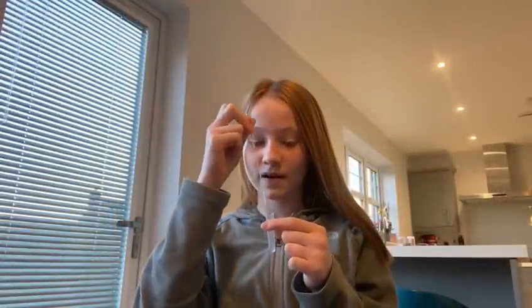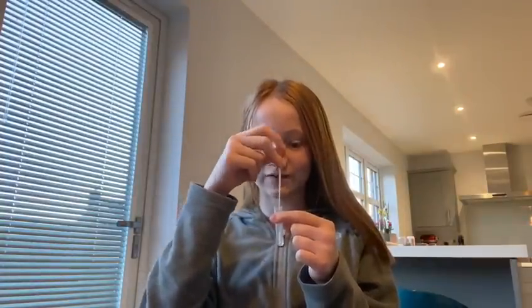Now you take the swab, put it in the solution and swirl it round and squeeze it for about 10 seconds.